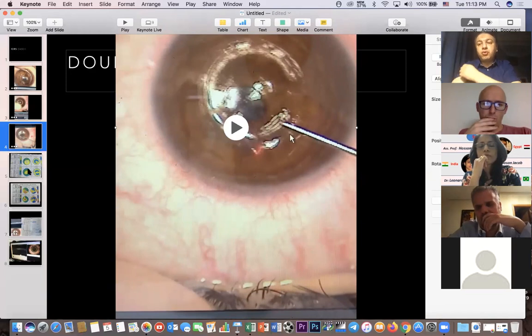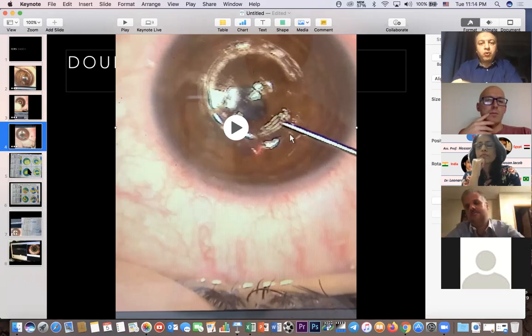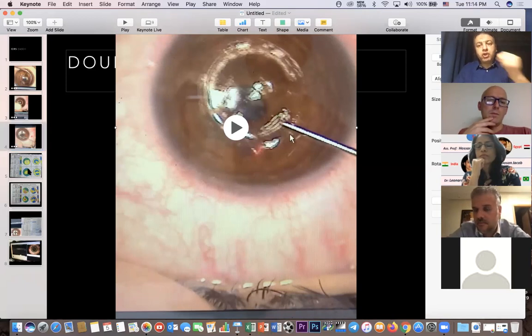So the last question, to make it more beneficial for the participants and the audience: what about the selection of the segment arc length? Are you using two segments, or one large one, or according to the cone diameter, the optical zone diameter and its position in the cornea?